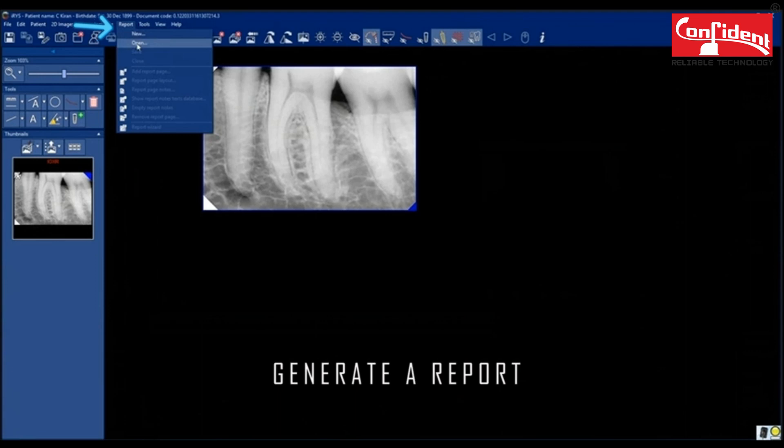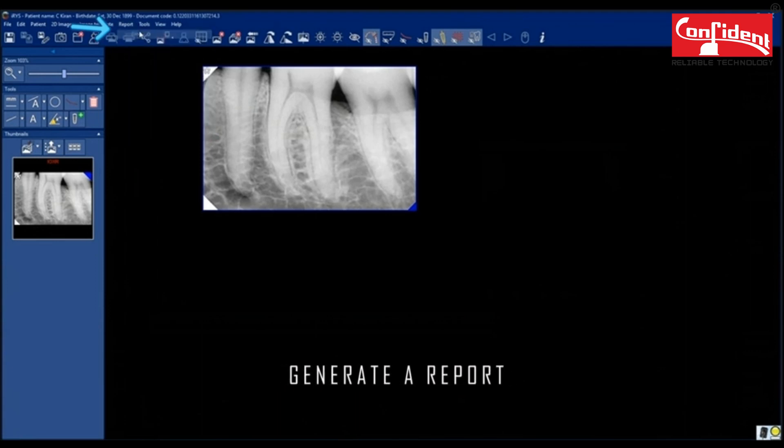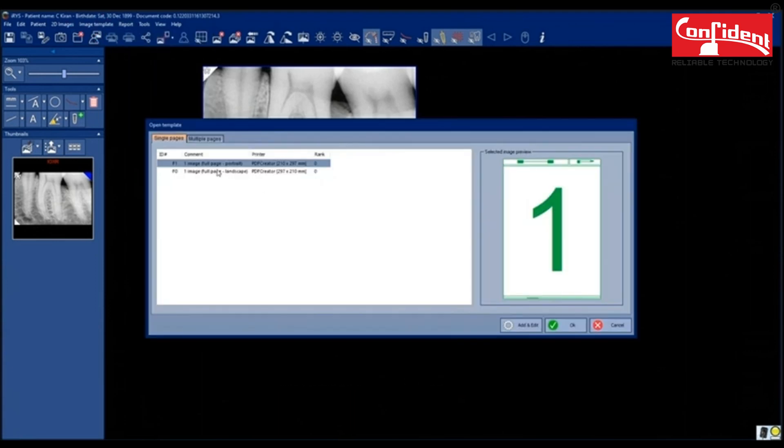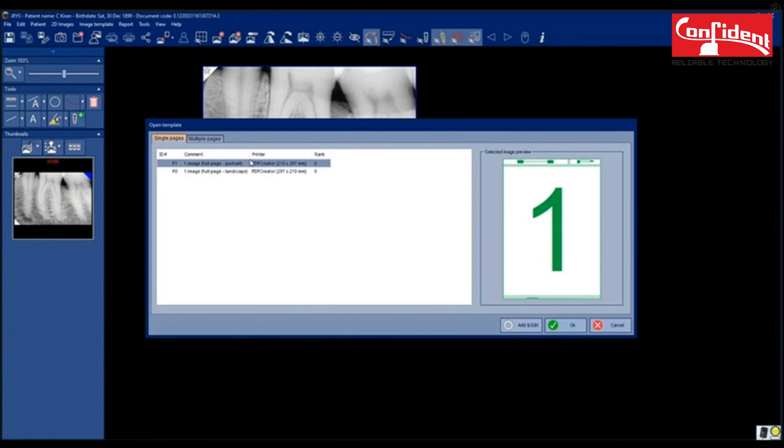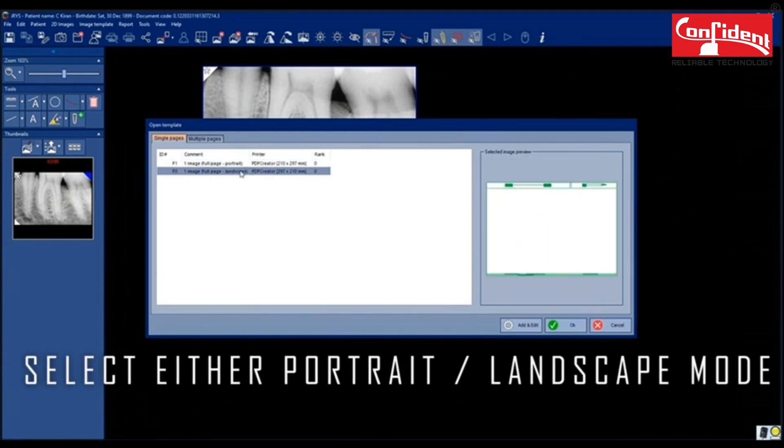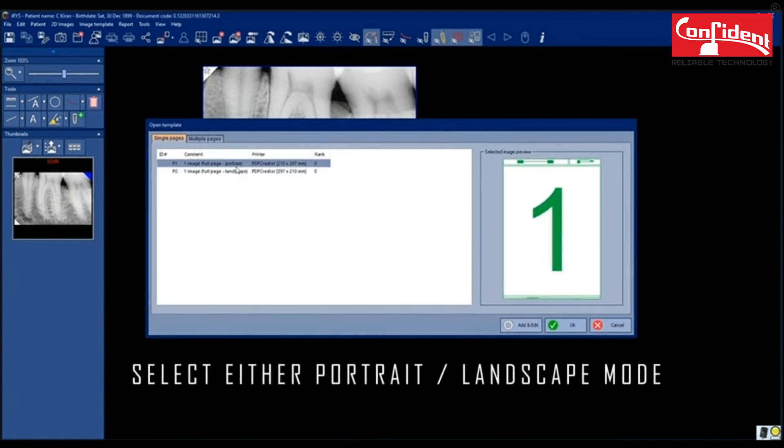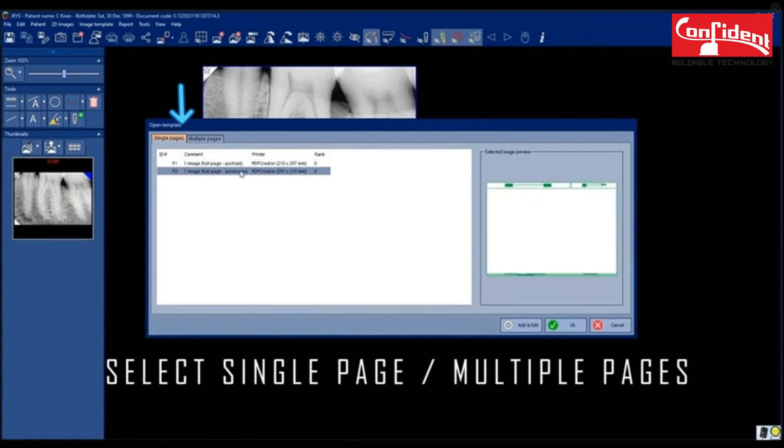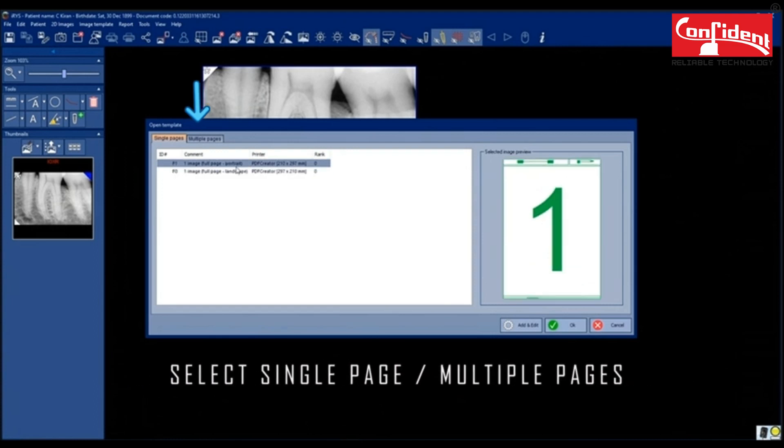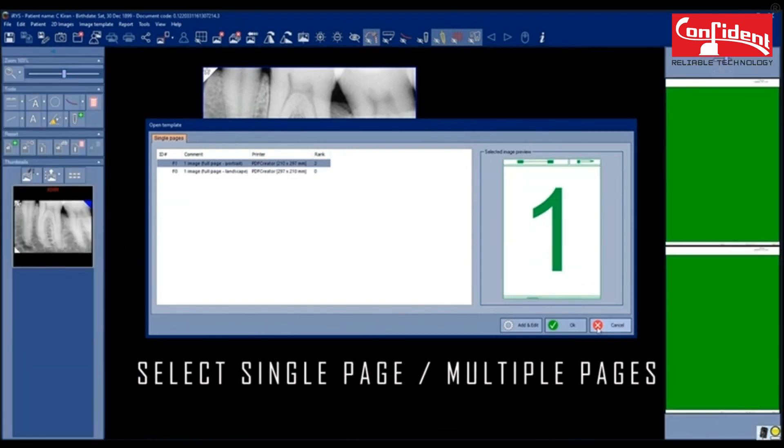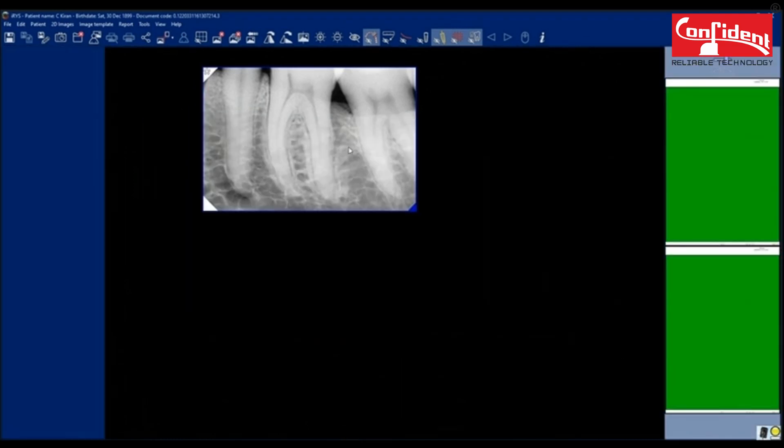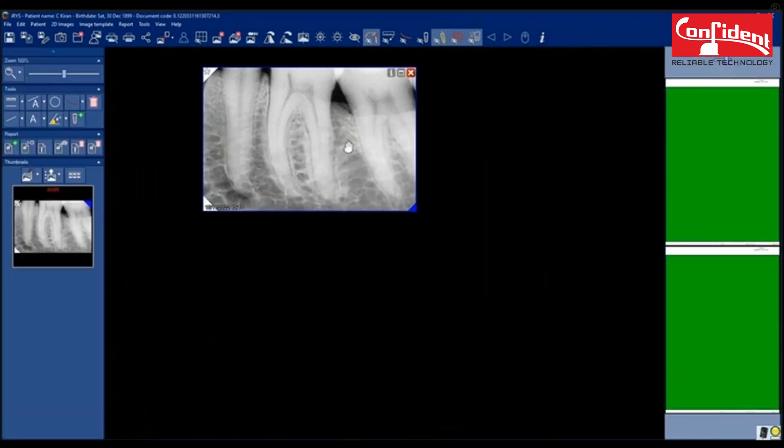Now to generate a report, click on report tab. Here select the orientation of the report. Portrait or landscape. You can also select single page or multiple pages. I have selected a portrait mode.